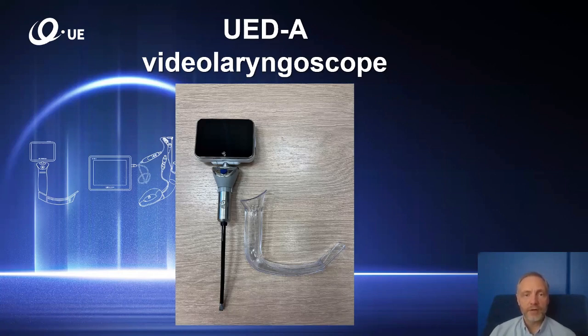The UED video laryngoscope has the possibility of taking pictures and recording videos. This, in my opinion, is very important regarding the nowadays tendency to have a full medical history of the patient. So you can record the intubation efforts and keep them in the medical history of the patient as proof of how the intubation was performed.